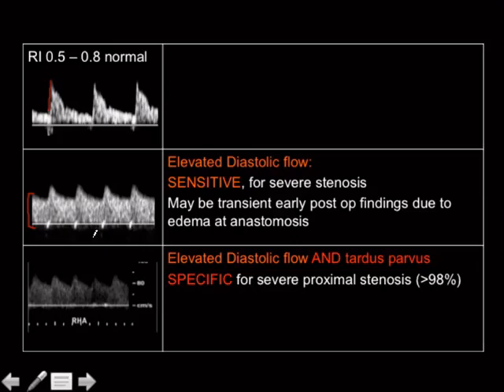It wants to eat all the time because it's basically been put on a diet, because the vessel is narrow, right? So during systole, it's not getting as much as it wants. It cries out for help, and it drops its intrinsic resistance, increasing the diastolic flow. So increased diastolic flow is a sign of a hungry, very thirsty liver.